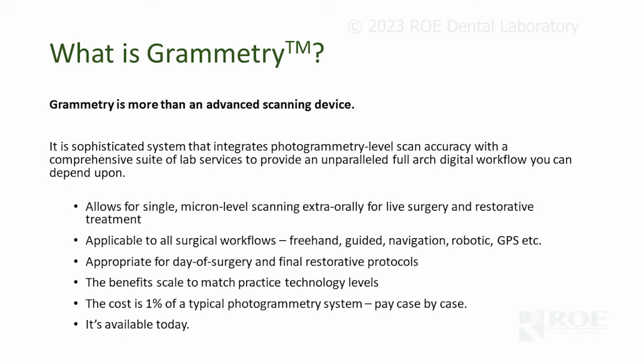So grammetry offers a different solution, right? A different way to get to the quote unquote perfect model, the perfect position of the multi-unit abutments. I'll have some images of what grammetry is, but grammetry is basically a scan body that you screw onto multi-units, you lute it together in the mouth, you scan it extraorally with your iOS scanner, and based on that, you can make a resin prosthesis, and then you use it physically to make a final restoration.